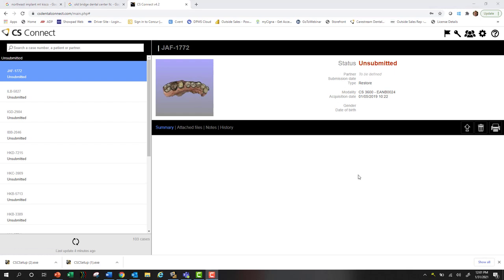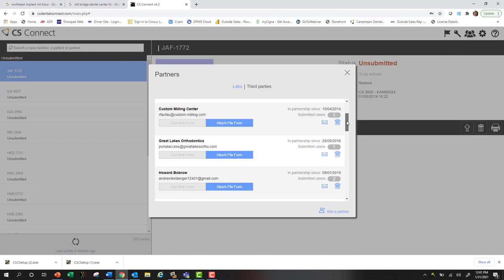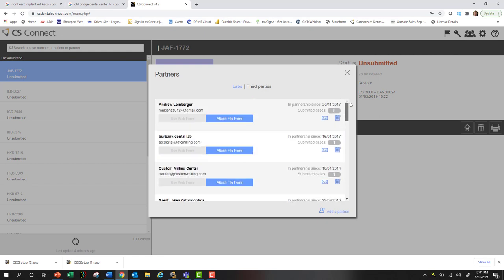Before we submit a case to a lab, we need to invite them as a partner. We can do that through our partner icon above. When I click on that, it's going to open a screen where we can see all of my existing lab partners.